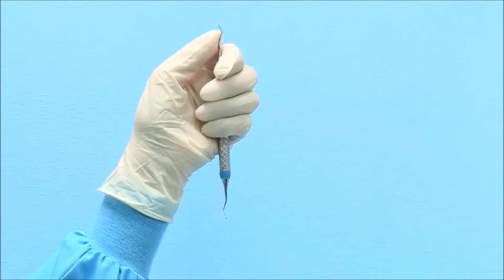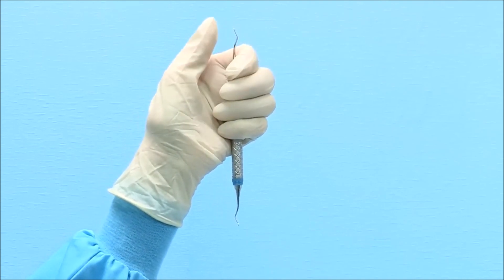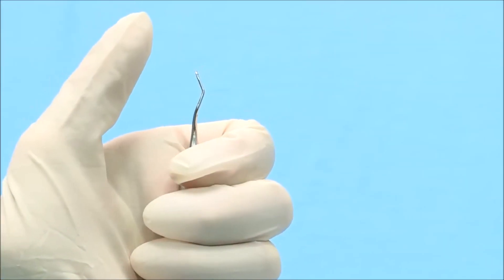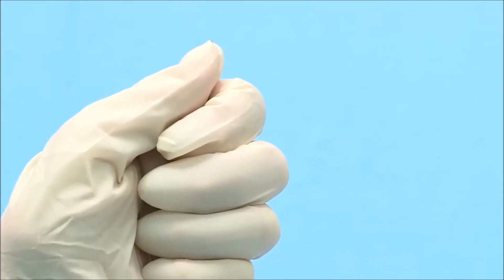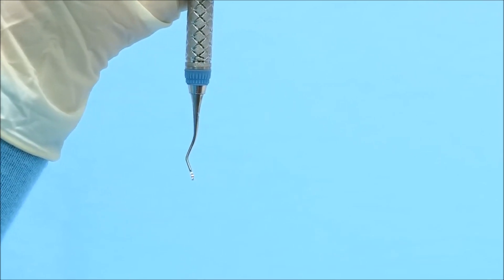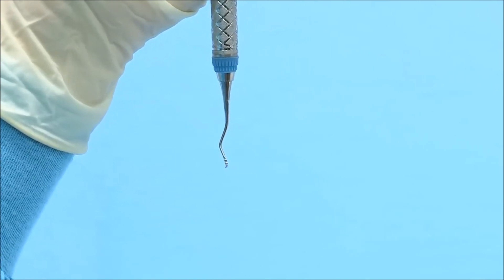To sharpen a Gracie Curette, begin with the odd-numbered end of the curette. Hold the instrument vertically in your non-dominant hand with the toe pointed toward you. Use a firm palm grasp and brace the top shank of the instrument with your thumb. The cutting edge to be sharpened will be on the right side of the blade. Focus only on the terminal shank of the instrument, which is the section between the blade and the last bend in the shank.